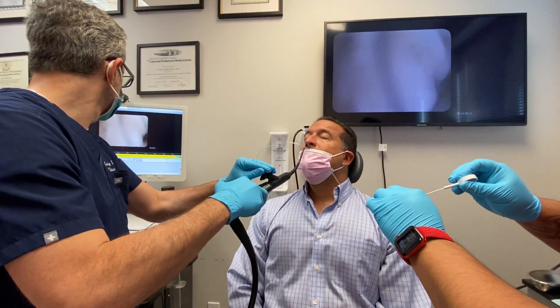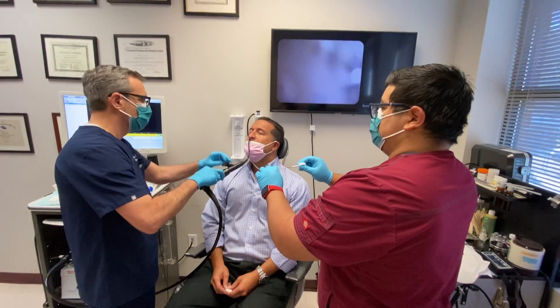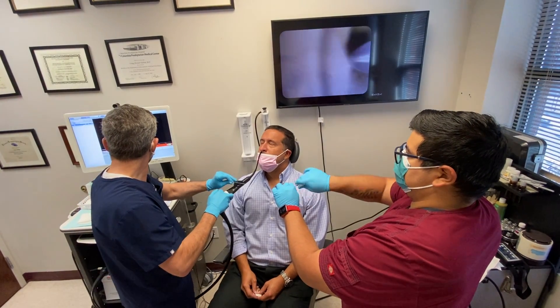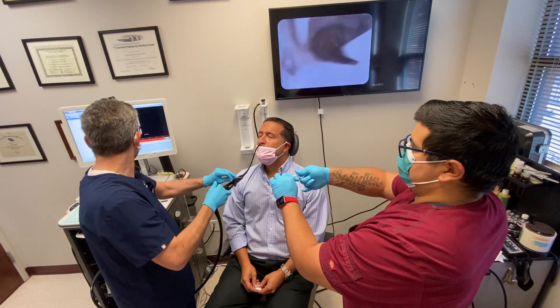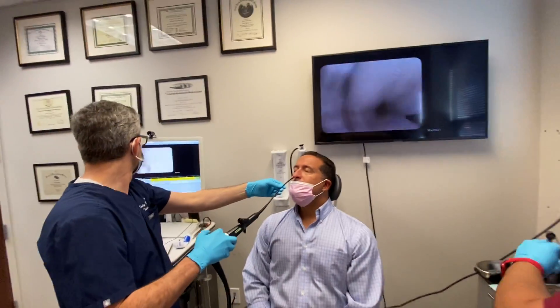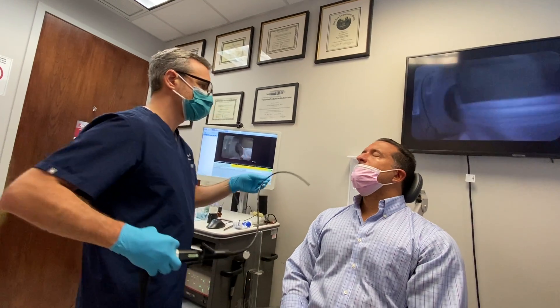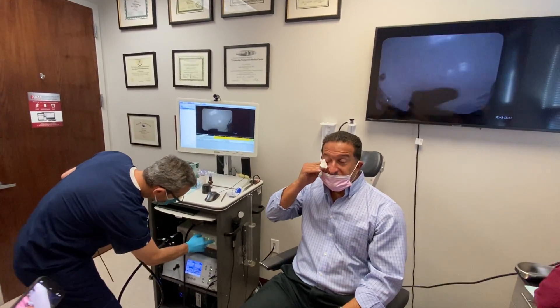That's a little bit better. You're doing really great. We're done. You did great. You're a champion. No problem — not even a gag reflex.